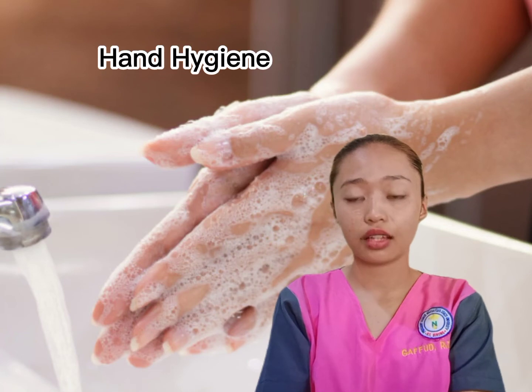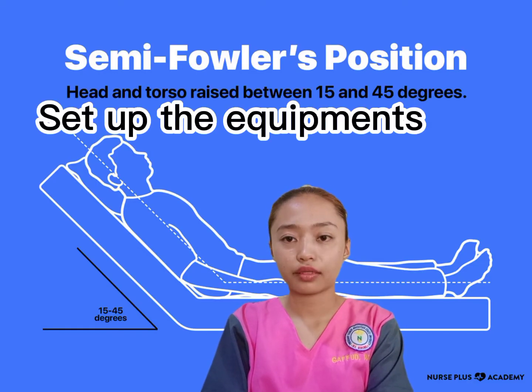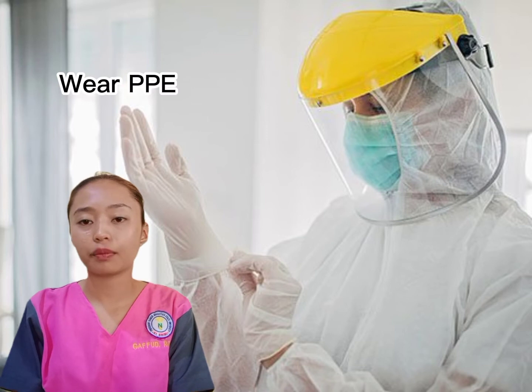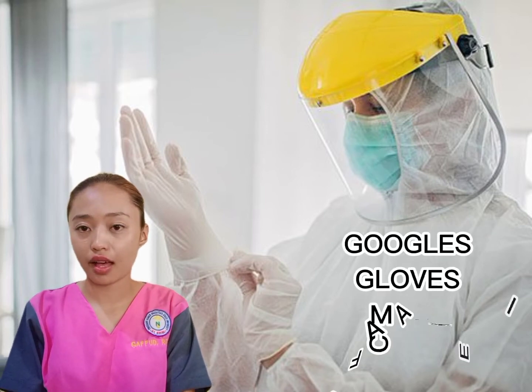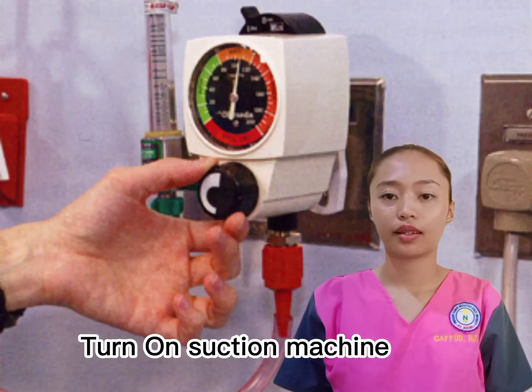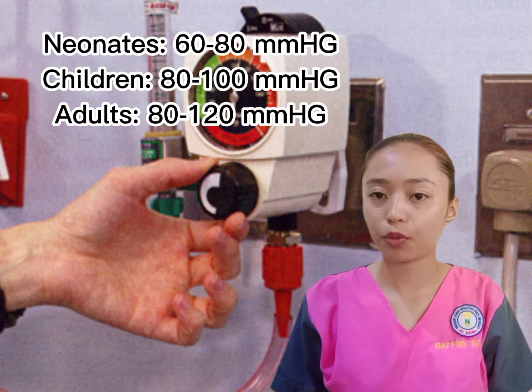Perform hand hygiene to reduce transmission of microorganisms. Next, set up the equipment and prepare the client in semi-Fowler's position if not contraindicated. Wear your personal protective equipment: goggles, gloves, mask or face shield, because of the potential for contamination. Turn on the suction apparatus and set it in accordance with the agency protocols.